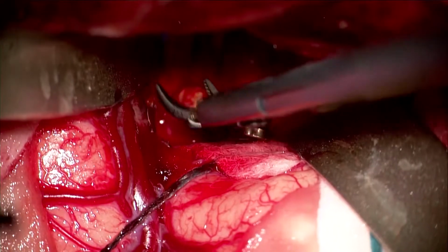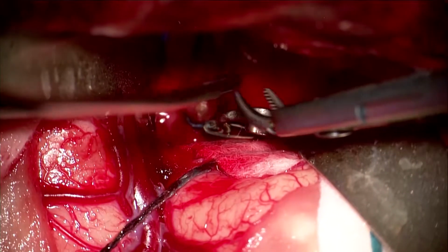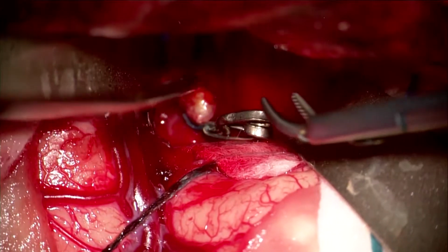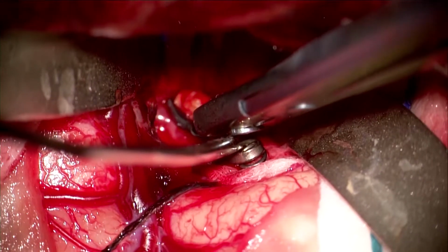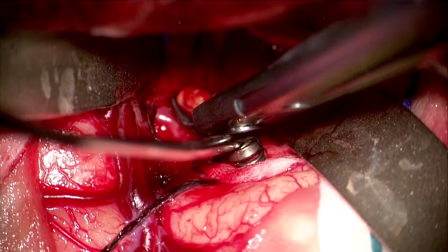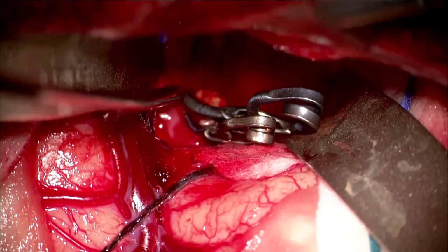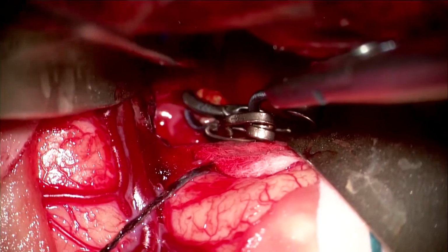Here is the second clip. If you look at the very deep portion of the aneurysm, you can see that there's a very small bit there by the sucker that was not closed. So I selected a slightly longer clip and placed that directly over the previously placed clip. Once this is performed, a final intraoperative angiogram will be performed to ensure that all the blood vessels are open and the aneurysm is indeed treated.